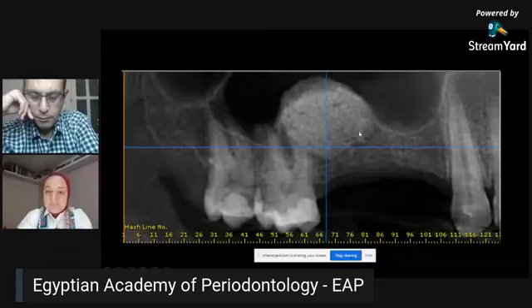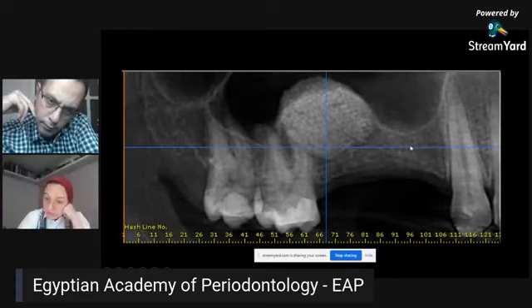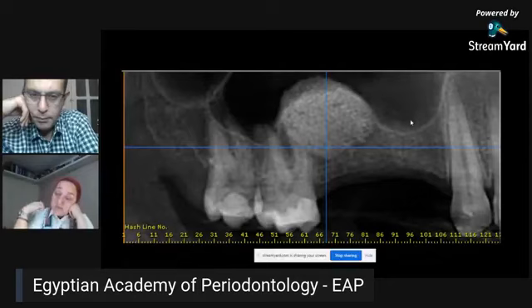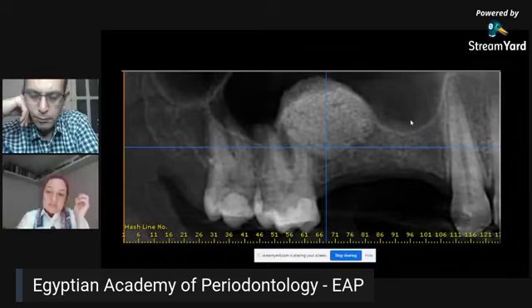Of course, you may think, why didn't you elevate everything and gain bone even in the mesial part? Because here we might need some crestal sinus lifting or internal sinus lifting with a crestal approach. We also discussed this because if we were going to elevate this part too, it was going to be a huge lateral window, and the morbidity would be very big. So we decided to go for augmenting the posterior part. And then at the time of implant placement, we're going to elevate internally the mesial part, which is a less invasive approach. He already suffered a lot after the surgery.